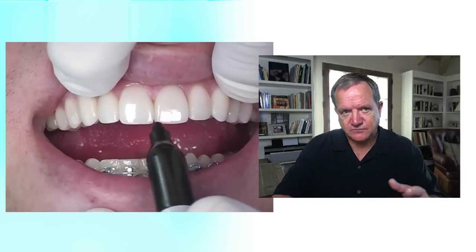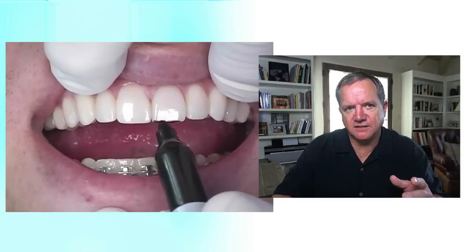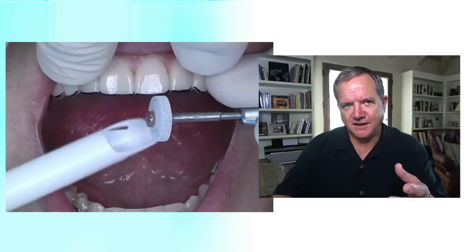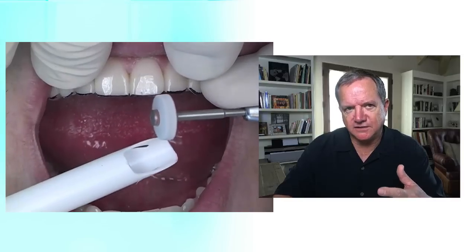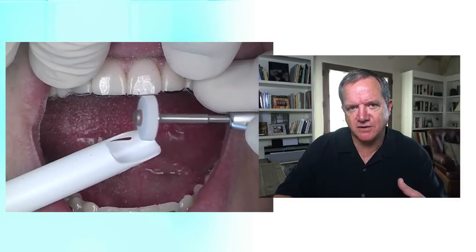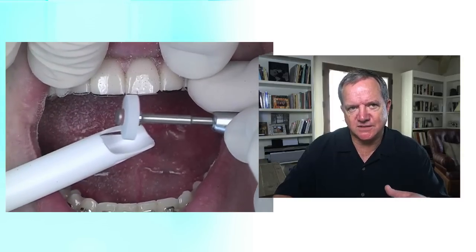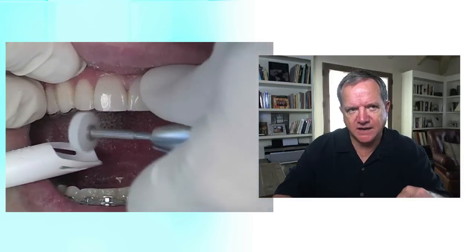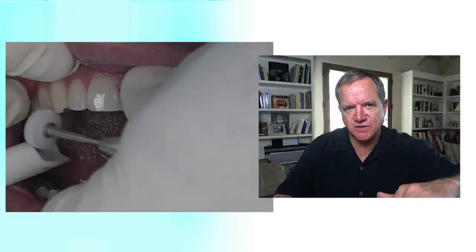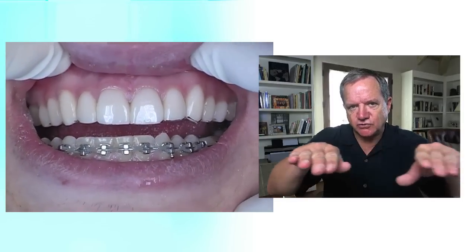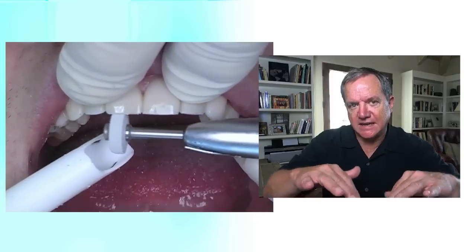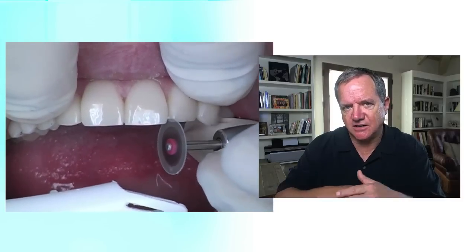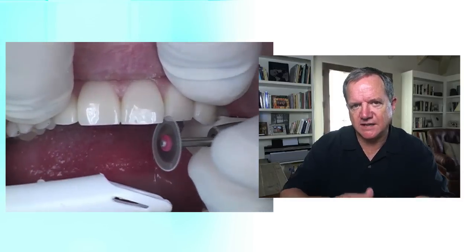Here's a video of using the black Sharpie marking pen — we always joke that it's a sterile Sharpie, but of course you all know we can't do that. Now I'm using a rubber wheel — this is a Brassler gray ceramic pre-polishing wheel in a straight handpiece — and I'm shortening by taking the black away. My first adjustment is literally to take the black mark away. You'll see I use it on the cuspids and premolars as well, taking the black mark away so now everything is shortened. Then we put that bevel back in the incisal edge, because now the incisal edge is too thick after shortening.